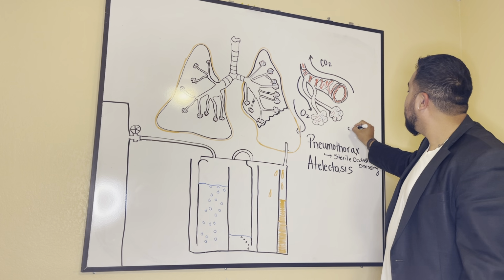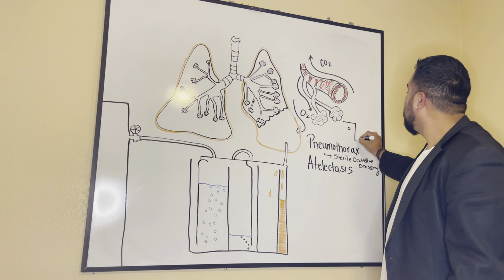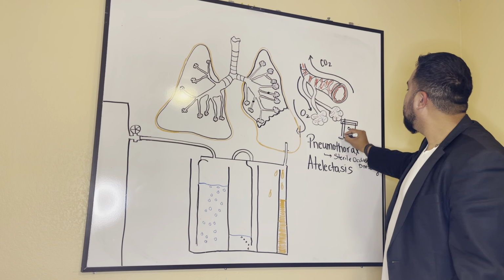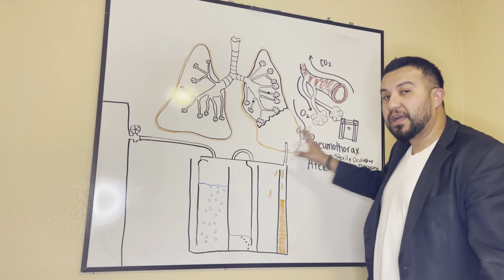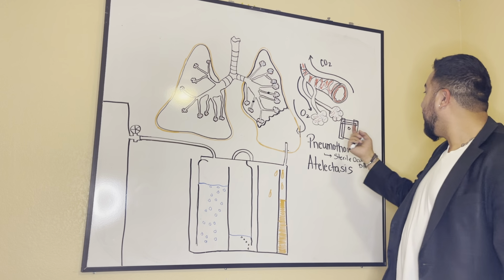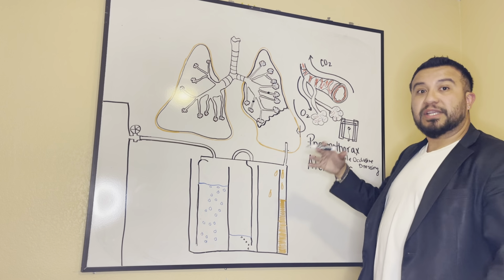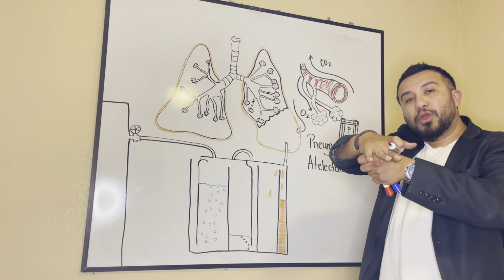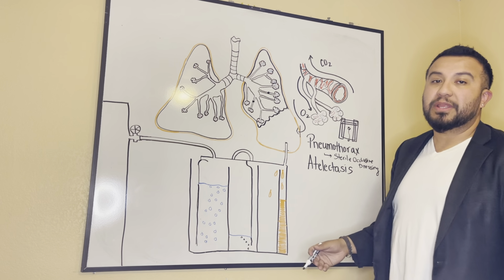And when you do place that, let's say this is the opening of the chest, the hole of the pneumothorax, you put the sterile occlusive dressing like such, and you tape 3 sides. The reason why you want to tape 3 sides is because if the air is going to passively come out, well, that fourth piece that's not taped together will open up and the air may actually come out. But if for whatever reason the sucking chest wound is sucking the air in, well, the sterile occlusive dressing will flap and close on that opening and will prevent further air from entering the area and exacerbating the pneumothorax.